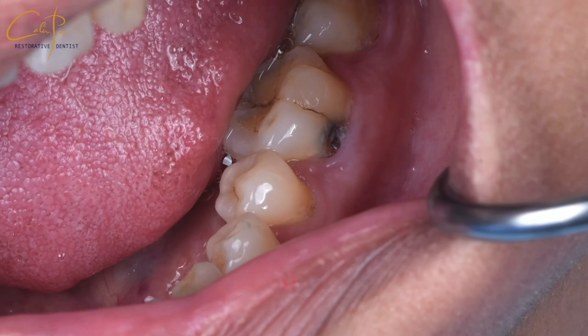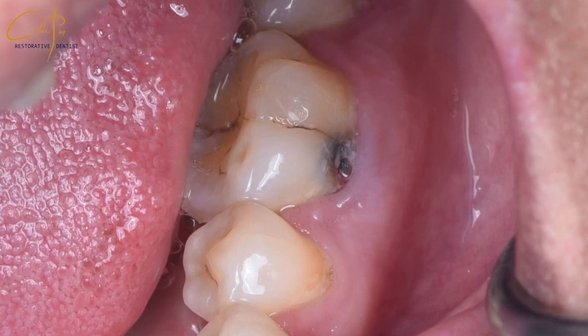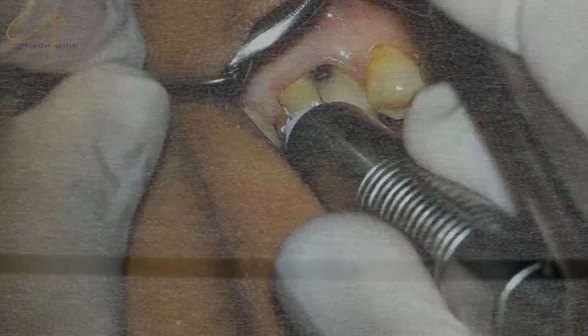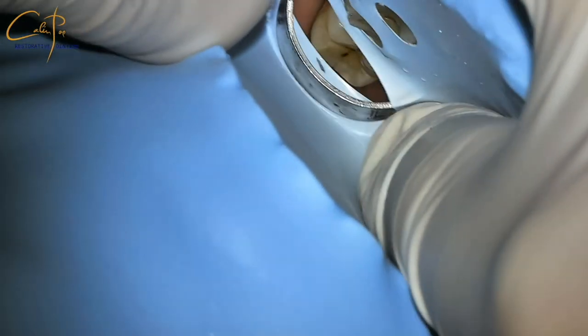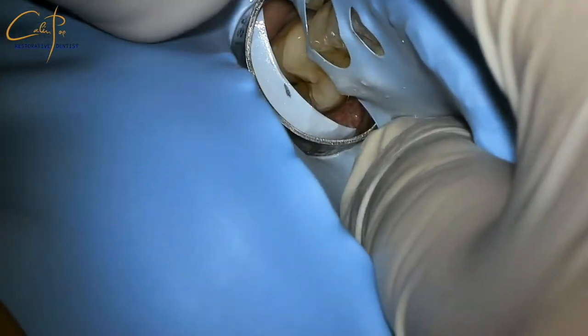Let's observe the integration of the rubber dam isolation in an even more difficult scenario — deep caries in lower molars extending under the gum. For hand control, I think the stylus syringe is much better. Most sheets, especially the latex ones, will tear when you try this approach with a winged clamp because the perforated hole has to extend.